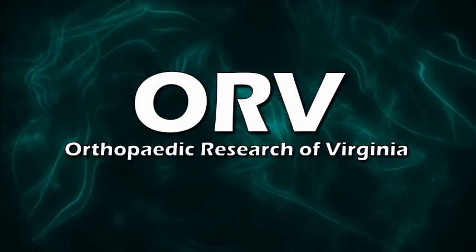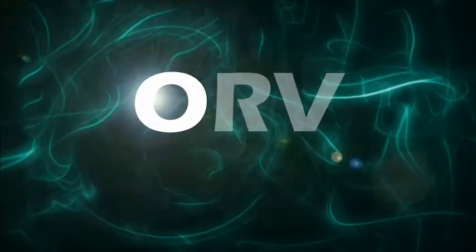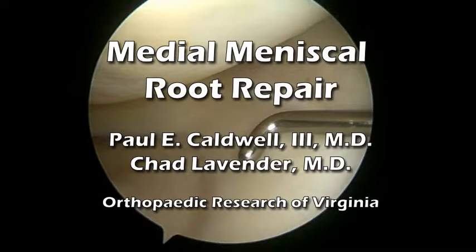The following is a surgical technique video on medial meniscal root repair by Drs. Paul Caldwell and Chad Lavender of Orthopedic Research of Virginia.